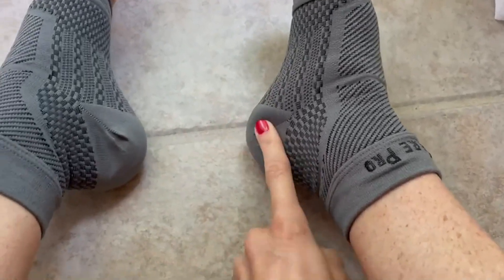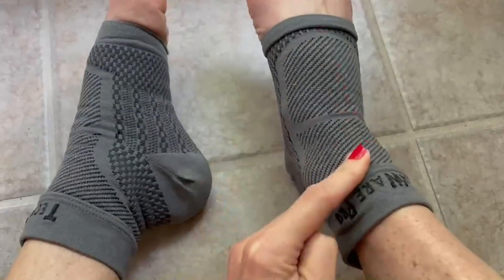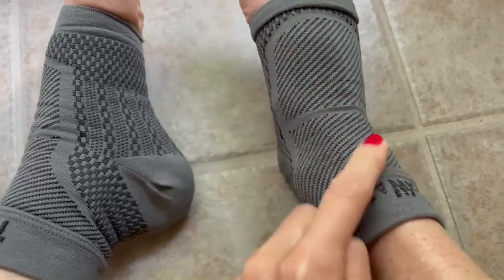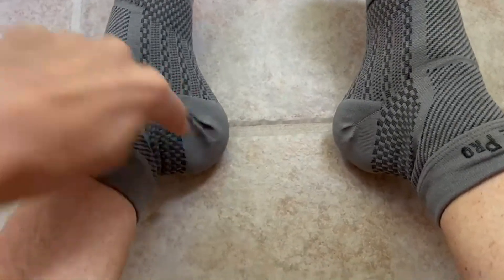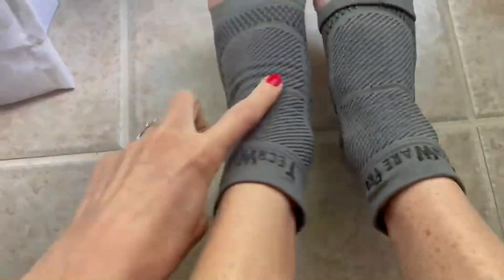They also help with compression on your heels, and as you can see there's compression on the top of your foot too. So they offer multiple angles of support for your heel, Achilles, ankles, and the tops of your feet.